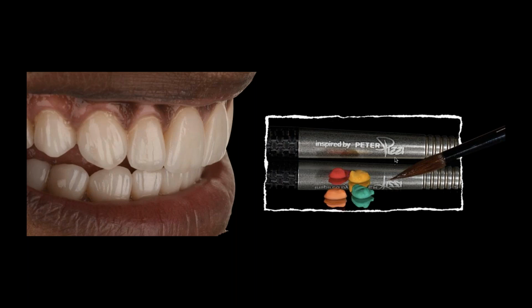All right. On your mamelons, you mentioned mamelons, opacious dentin. Which one of those are more opacious in your opinion? The mamelons are definitely more opacious dentin. Opacious dentins tend to fall in a scale of anywhere from 45 to 60 units of opacities. Mamelons tend to be anywhere from the 60s to the 80s, depending on what kit you use and their fluorescence.